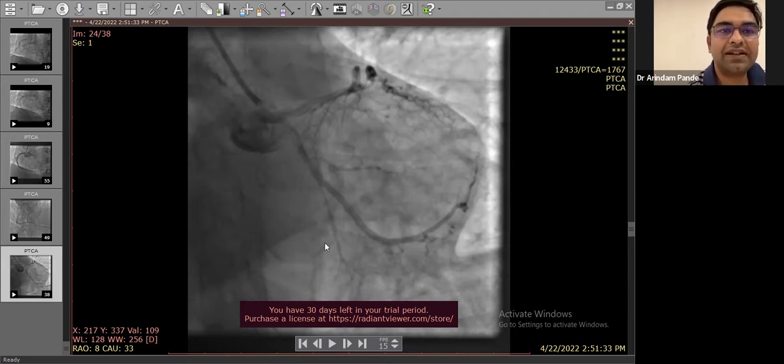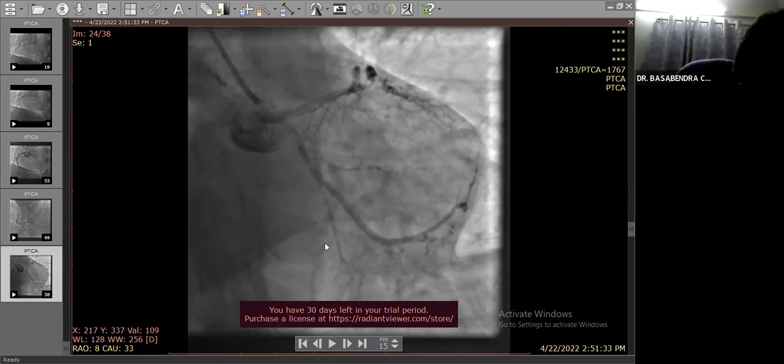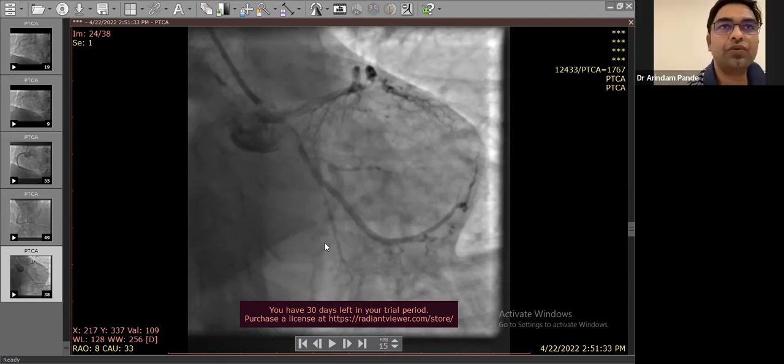The case was very nicely done, right-sided, but the only comment I can make is that, if available, IVUS could have helped a lot in deciding the stent size, as well as how much post-dilatation we will do, particularly in the proximal segment. I also want to know your plan about the LCX. LCX is very tricky because of the ostial LCX lesion many a time. So what is your future plan about the LCX, because that is also a critical lesion? Your comments.